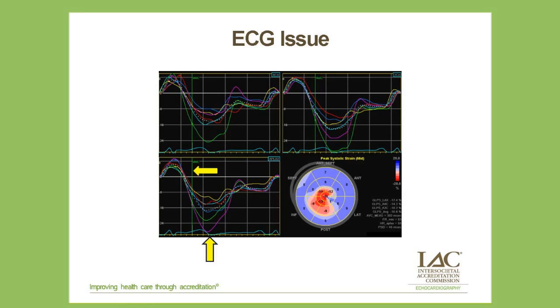So she had measured it, and usually aortic valve closure is just past the T-wave here, and that's where she measured it at. But for some reason, the system pulled it up to prior to the T-wave. And so what we noticed is that the T-wave itself is slightly higher than the QRS, and we thought that maybe played a role in it confusing the algorithm there where it uses to calculate it.